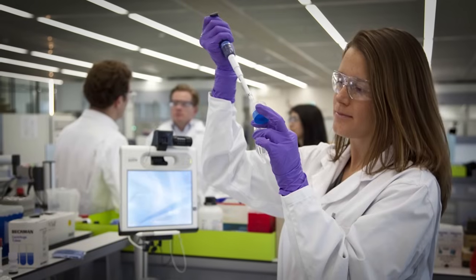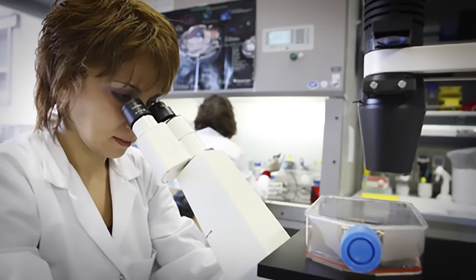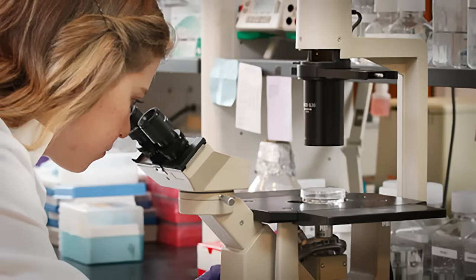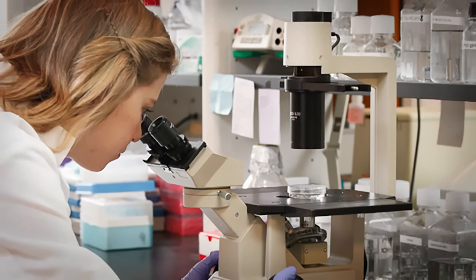Compared to immortalized cell lines, however, primary cells can be finicky and present challenges during culture unless proper care is taken. Cell Applications recommends the user follow the steps outlined in these video segments to achieve optimal results with their primary cells.